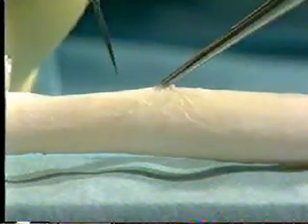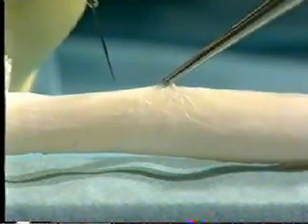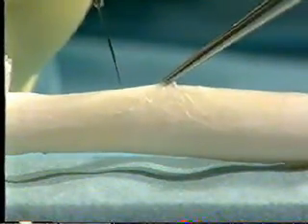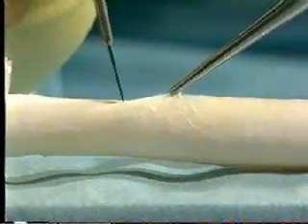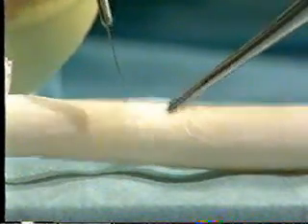Take a fine pointed blade and make a short stabbing incision in the anterior wall of the simulated artery, taking care not to go too deep and penetrate the opposite wall.